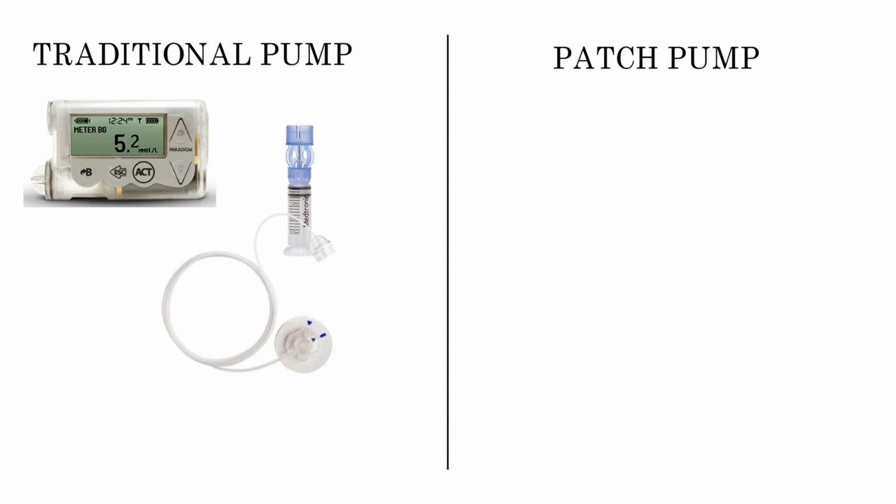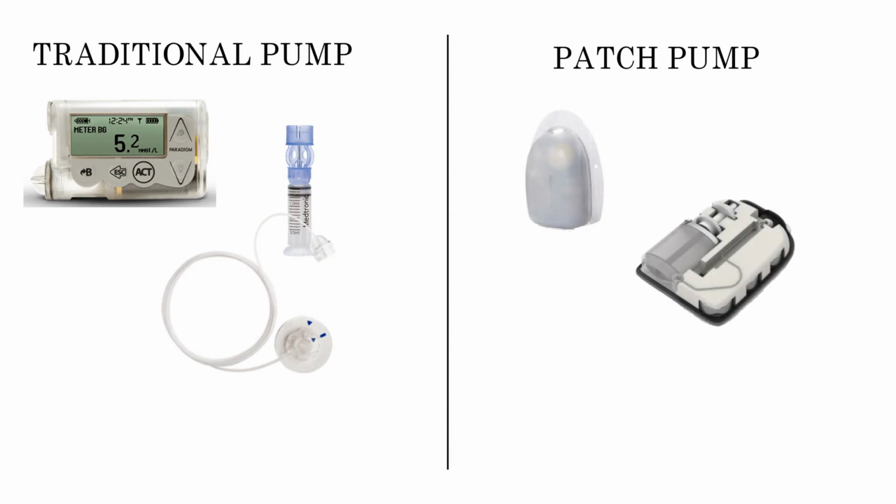Traditional pumps have an insulin reservoir and attached to the body with tubing and an infusion set. The buttons on the pump allow you to program bolus insulin for meals, basal rates for insulin delivery throughout the day, and to suspend insulin delivery if necessary.